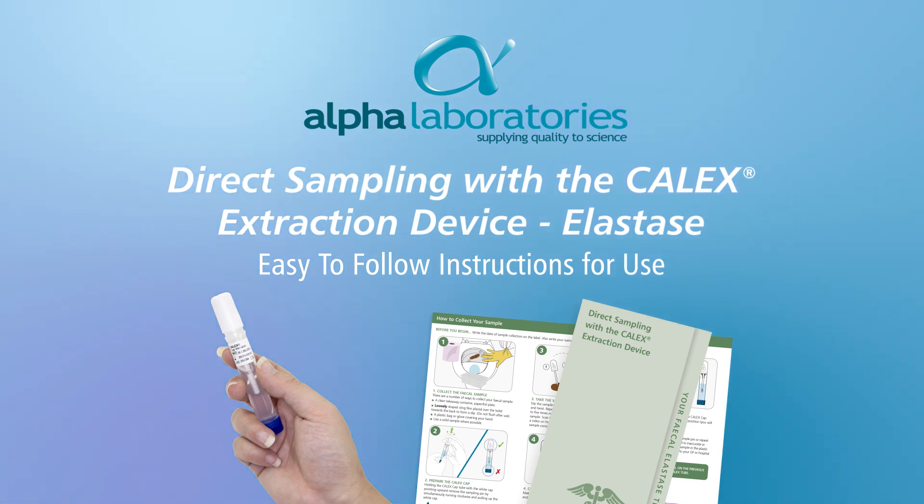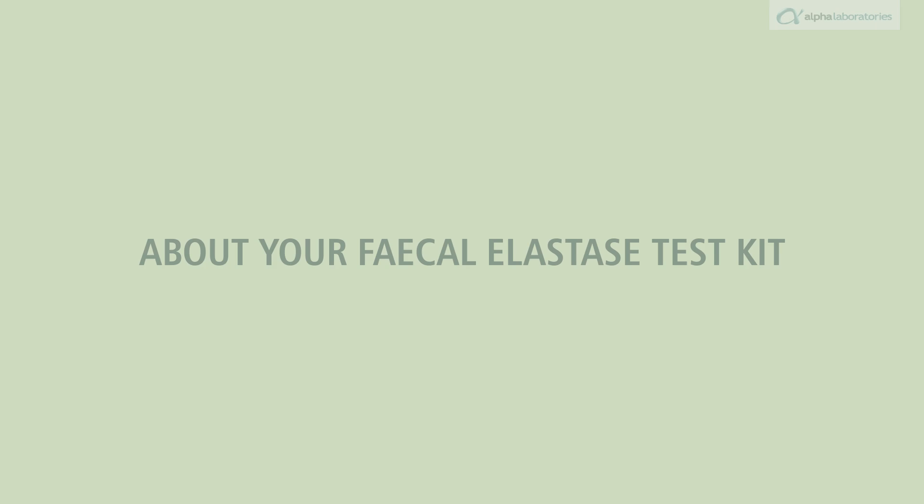Welcome. This easy-to-follow instructional video will guide you through how to use the calyx extraction device to take a fecal sample about your fecal elastase test kit.